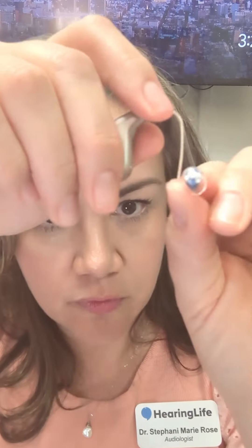Once you're done wiping your hearing aid, place it in the charger. You're probably wondering — is there a left and right hearing aid? Yes, there is. Each ear is individually tuned for your given ear's hearing loss, so it's important we don't get them mixed up. If you put the right ear hearing aid in the left ear, it sort of points at a weird angle and won't go in easily. On the back of your hearing aid you will find a red marker, and the end of the speaker is also red versus blue for the left. You can remember that like R and R — red is right.